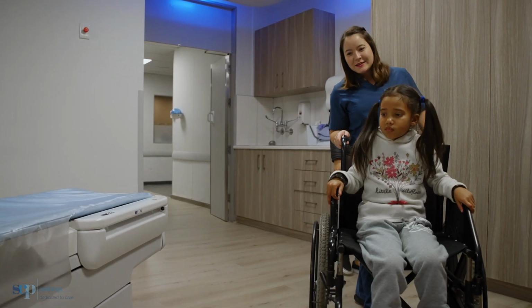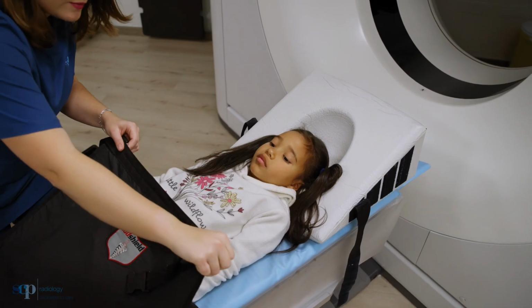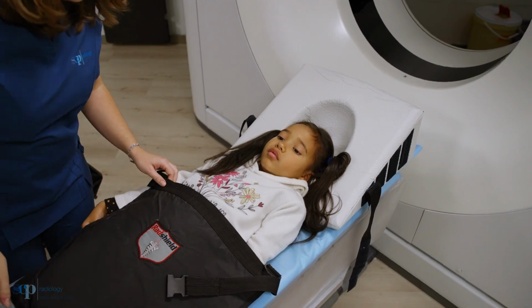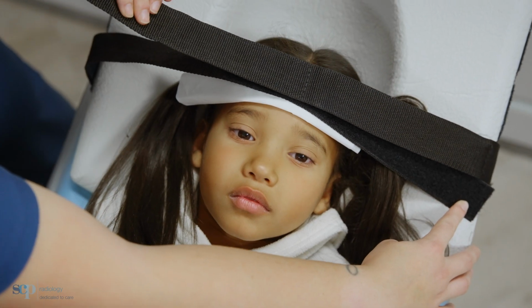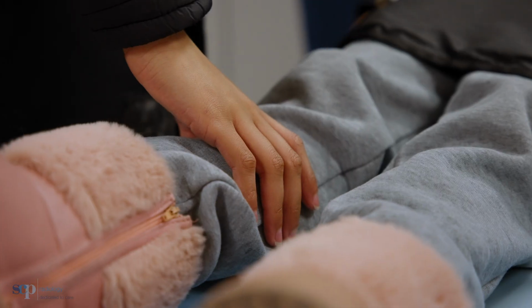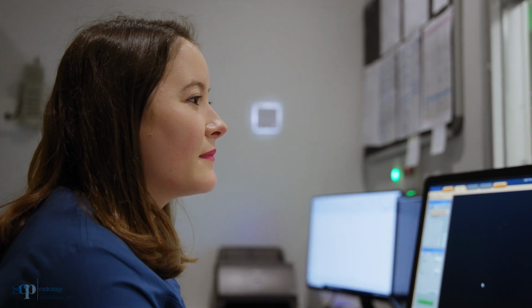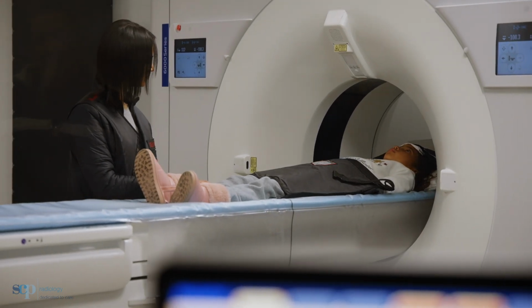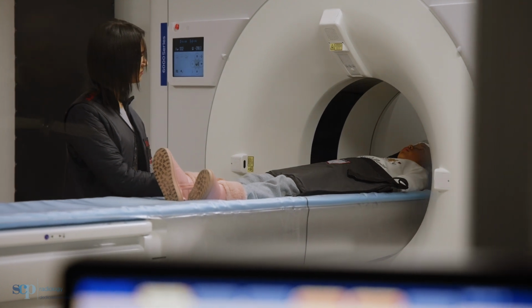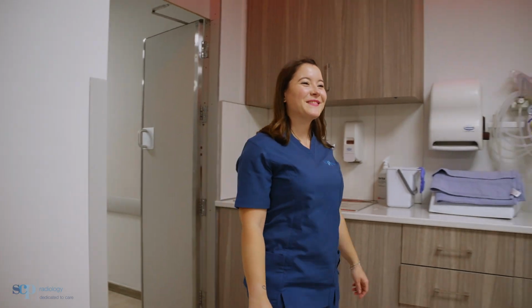So when a child comes for a CT brain, we will lie them down on the bed. We cover them with lead shielding over their gonads to protect them from the radiation. They just lie on a special cushion to secure their head, and then the bed will move through. It's a donut circular shape. It moves through there twice. We do a planning scan first to make sure that we cover the brain so that we're not just shooting in the dark. And then we'll do the full scan where they scan the entire brain.